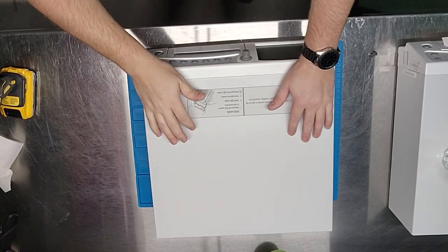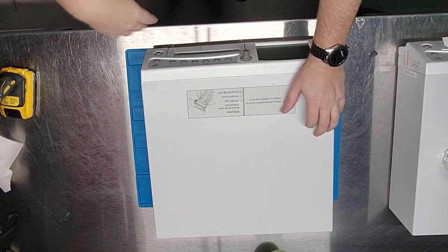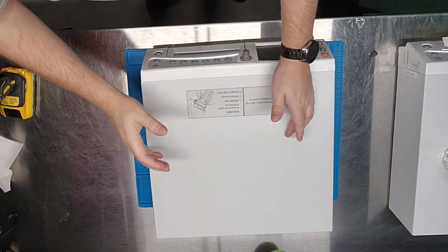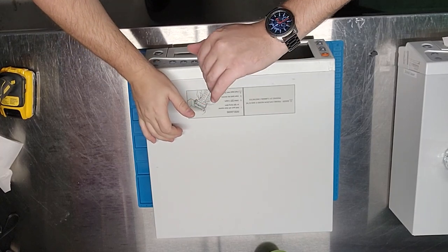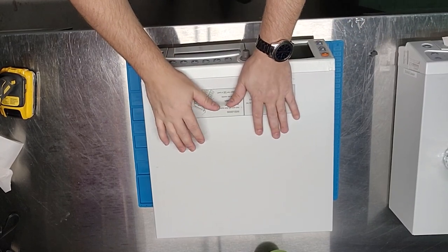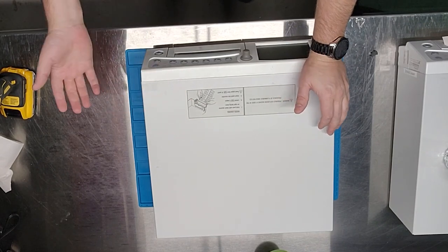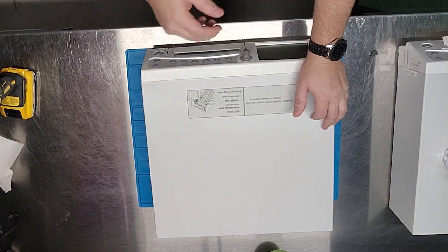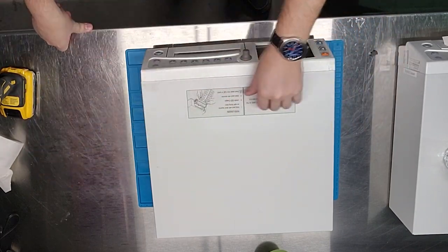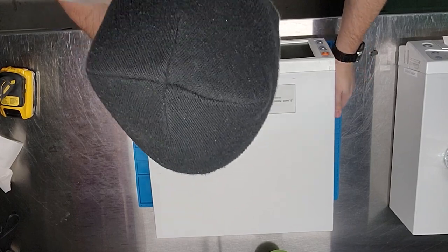Hey guys, welcome back to Better Biomed. It's right before Christmas, I'm in the warehouse at around 5 or 6 AM. I had a bunch of fetal monitors come in and I thought I'd run through one — show you its functionality, some stuff on the front, and then take a look inside the device.